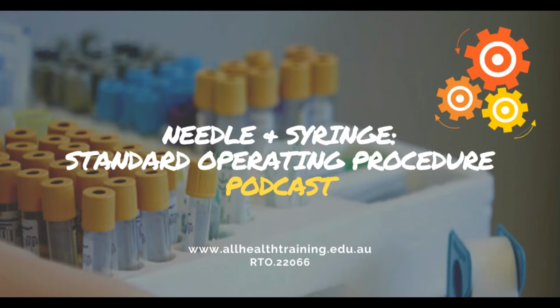Look for the bevel in the needle. This is the eye of the needle. Line it up with the numbers on the syringe and connect the needle to the syringe and slightly twist downwards and to the left. The bevel should now be to the left of the numbers. Place the syringe down in the clear packaging. Apply your gloves and place the kidney dish within reach. Retighten the tourniquet.